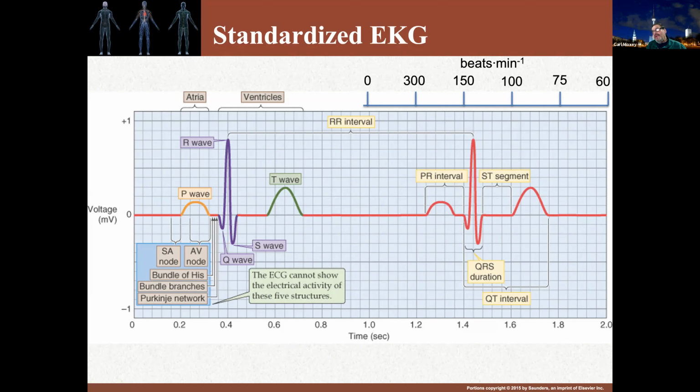The other thing to pay attention to in the EKG is regularity. Regularity measures the RR intervals and the PP intervals. If both of these intervals are consistent, it shows that the tracing is regular. If there's a repeating pattern, it indicates that it is irregularly regular. However, if there's no specific pattern, it means the tracing is irregular. So we have these 3 terms that we can apply to it.